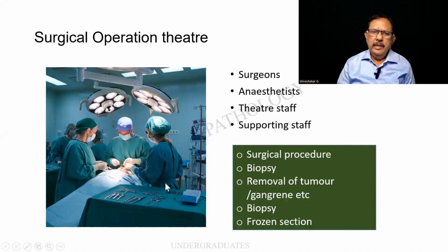This is a surgical operation theatre, and these are the main functional staff: the surgeons, anesthetists, theatre staff, and the supporting staff, in which we have a lot of surgical procedures going on, including the biopsy, removal of a tumor, a gangrene, etc., and also frozen sections.